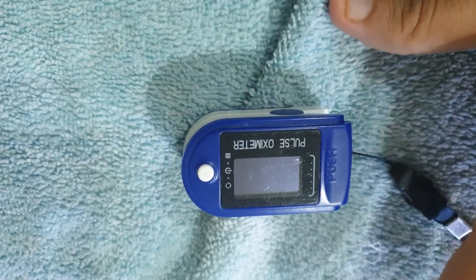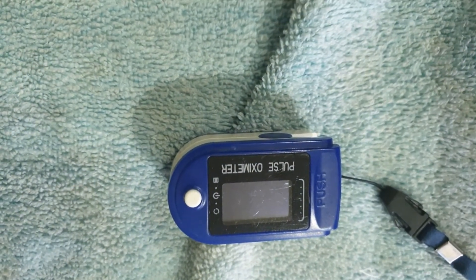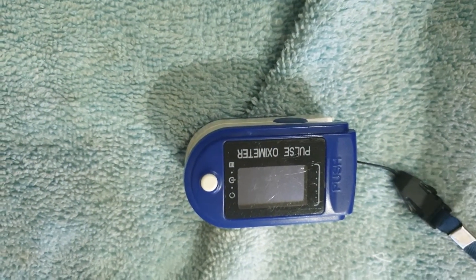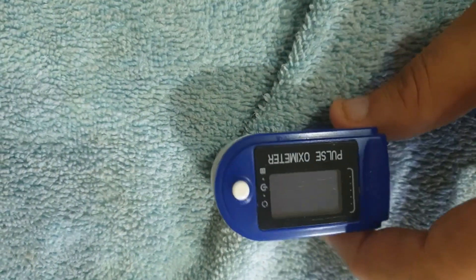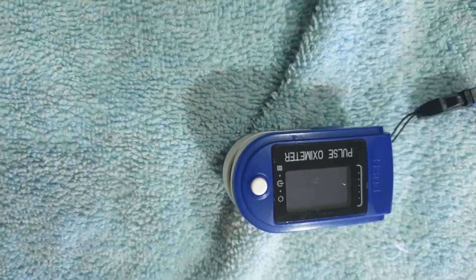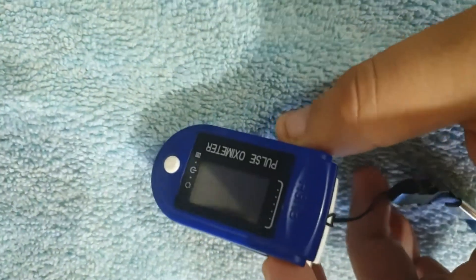Pulse oximeters are of various types. It can be a finger probe like this one, it can be a Masimo or a Nellcor, which are used in hospitals as bigger machines. There are many types of pulse oximeters. You can buy any one that you want, but try to avoid cheaper Chinese versions and go for branded ones. These devices are operated by pencil cell batteries on the back.